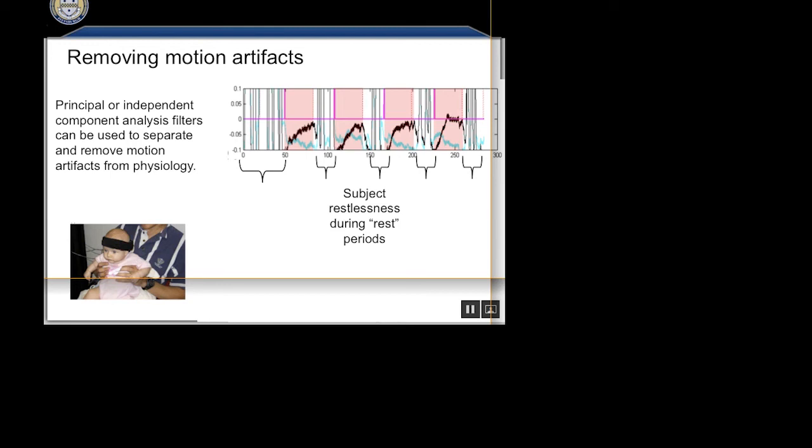And so when we do PCA for motion artifacts, we actually put in the entire matrix, because now we're looking for features that didn't care about wavelength. That tends to be a lot better for motion artifacts, because again, motion artifacts don't care about wavelength. They affected the entire data. This is an example, Teresa Wilcox's data again. I said there were huge motion artifacts during the baseline period.